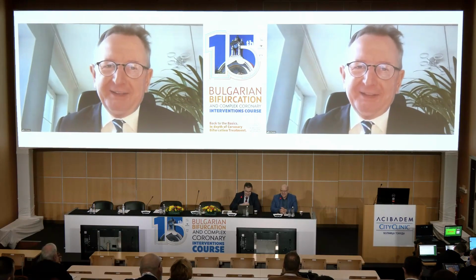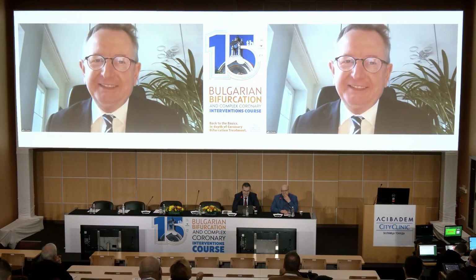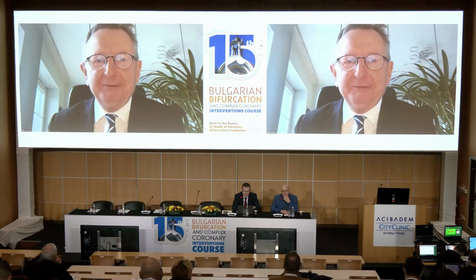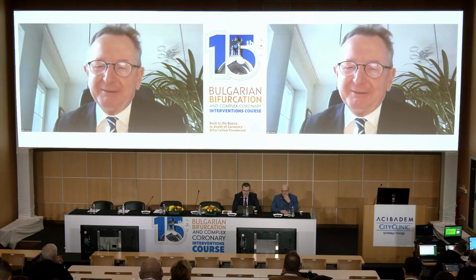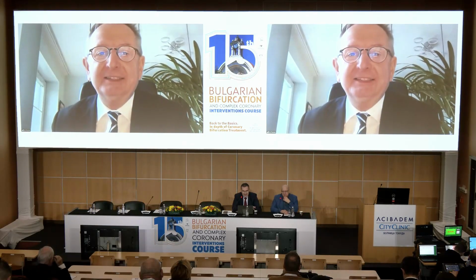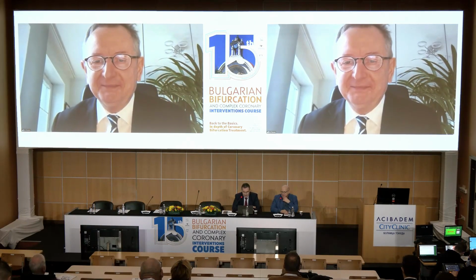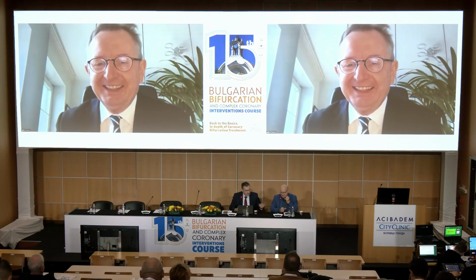And Dobrin, I have to say, I was in your center last year, and we had really very tough cases to manage in 2 days. And Dobrin showed me to use a drug-coated balloon for 2 minutes. We use this approach now in our center with a very, very good experience. So thank you for sharing this strategy with us. Yes, it's a good way. It is accepted in Germany, but not in Bulgaria. But you increase the rate of peri-procedural myocardial infarction. No, there is no problem.